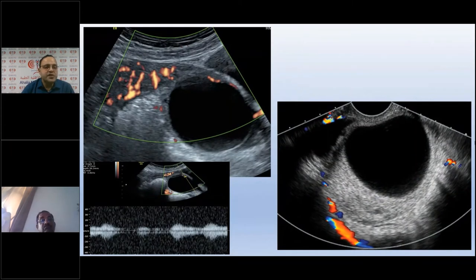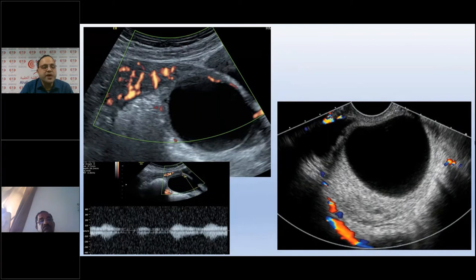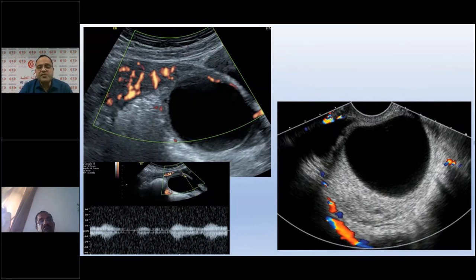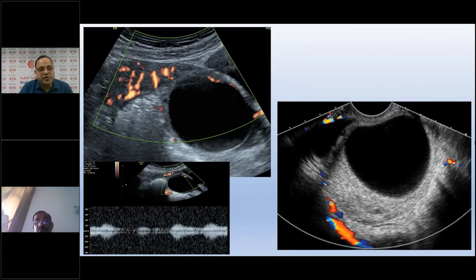Color Doppler is essential for large ovarian lesions to rule out torsion. In a normal ovary, vessels are visible in the parenchyma with confirmed spectral patterns. Spectral pattern differentiates real flow from artifactual color. A second case with a large follicular cyst showing no flow in ovarian parenchyma raises the possibility of ovarian torsion.